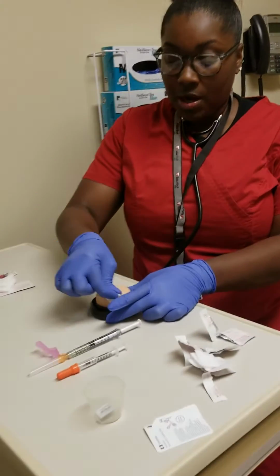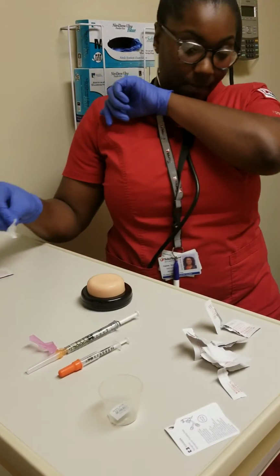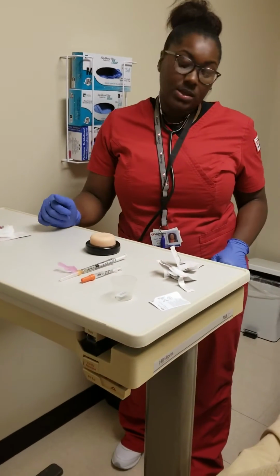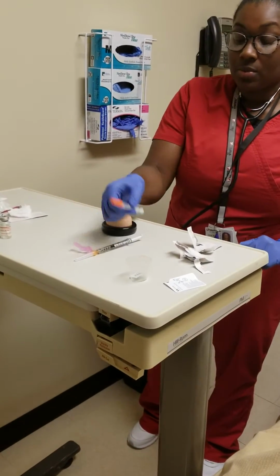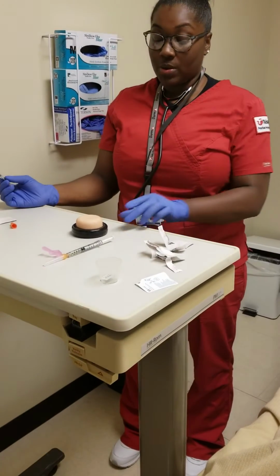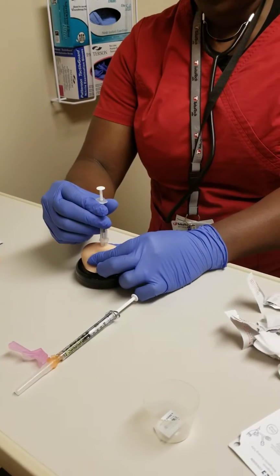So I would clean that area. I wouldn't blow the area dry. I wouldn't fan it because I don't want to contaminate the area. I will let it air dry. Then, since this is a subcutaneous injection, I will take my insulin, which is labeled with the patient information, so that's how I'll know which one it is. I will uncap it. After it has dried, I would pinch up the fat. I would inject like that.